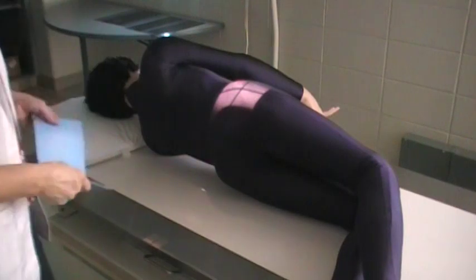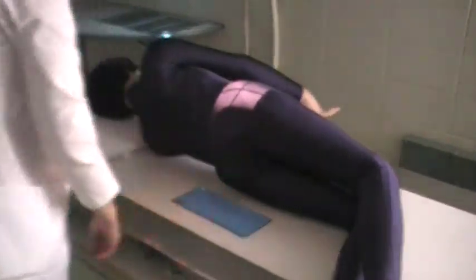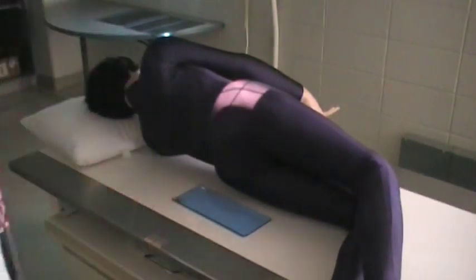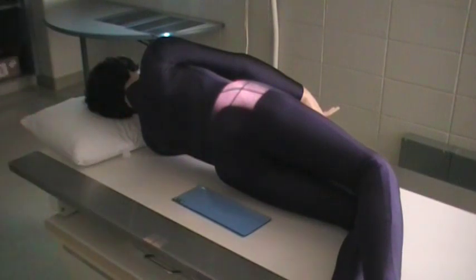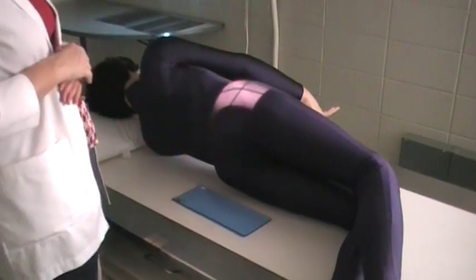With this image, you use the 10 by 12 image receptor or the 24 by 30 centimeter. You will place lead shielding behind the patient because this will clean up your resulting image — there's going to be a lot of scatter because we are X-raying through a thicker body part.